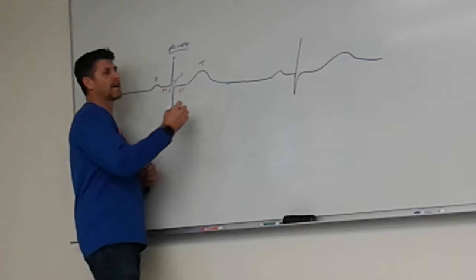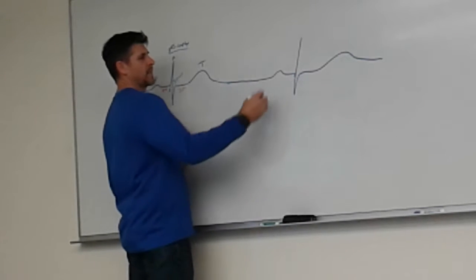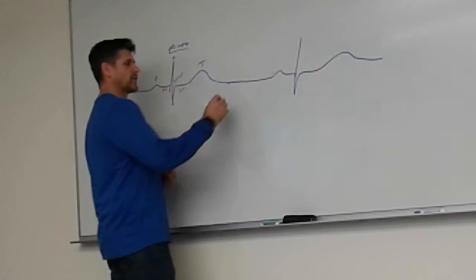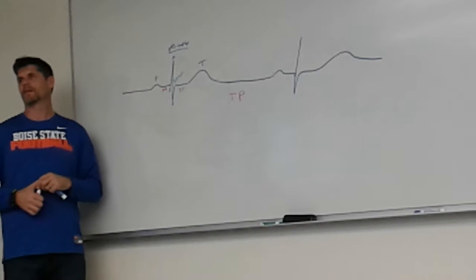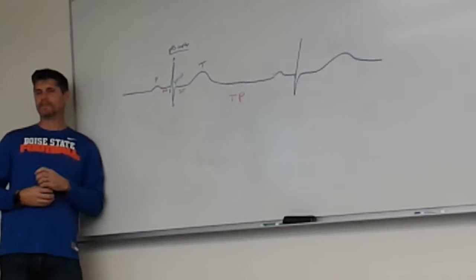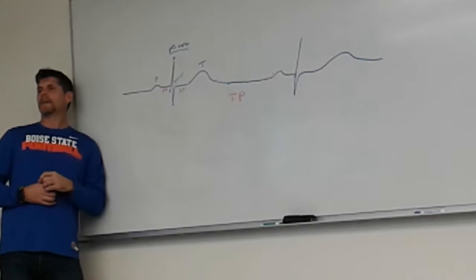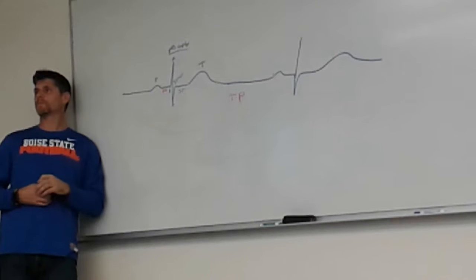And so the end of the T wave to the beginning of the next P wave is what we refer to as the TP segment. Make sense? Questions on that? You said you'll go over the U wave later? We will. We'll discuss the U wave.